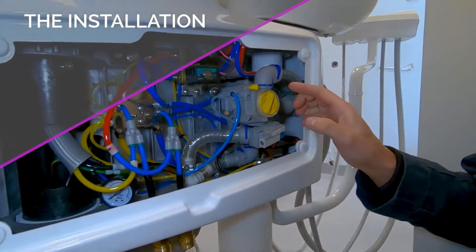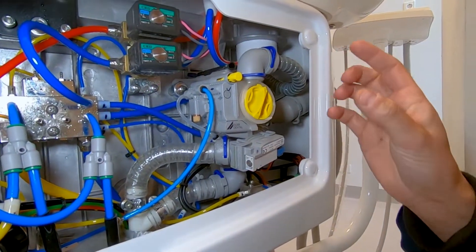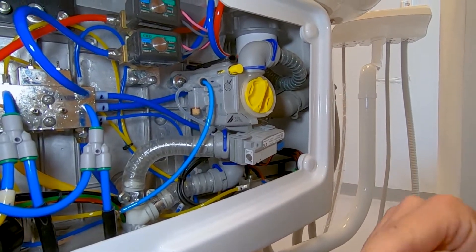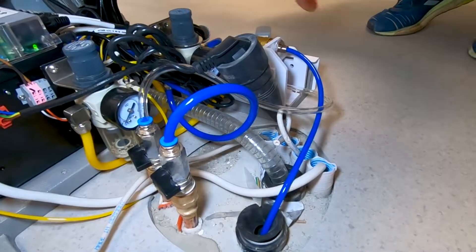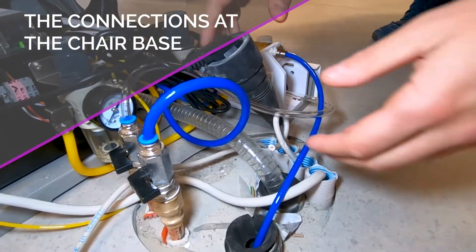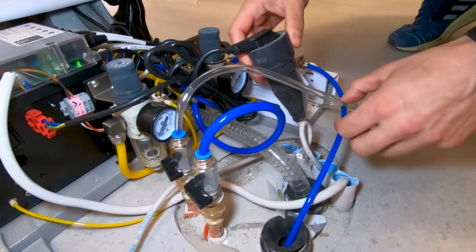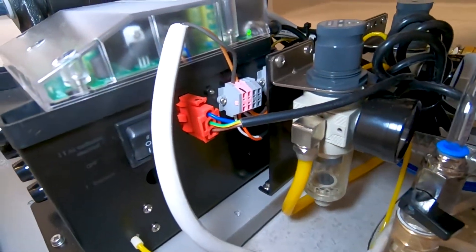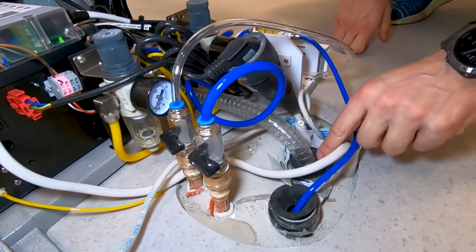The installation of the valve is quite simple and what I wanted to show mostly is how it is done and which are the connections at the chair base. At the chair base you have the water, the air connection and the power, then we have the input for the suction motor and then we have the pipe that goes to the suction.